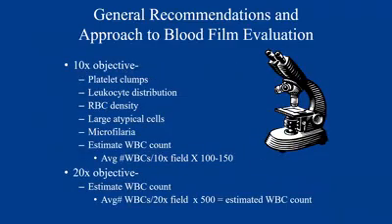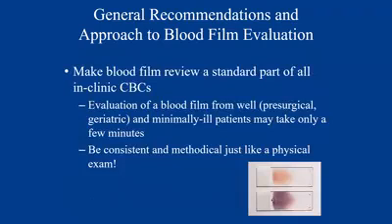I'm not going to go into exhaustive detail about what we do when we're actually approaching the blood film. Again, I'm assuming an introductory level of background that you already have. When you're doing blood film evaluation, you want to make sure you do your evaluation in the monolayer, which is generally about this area of the slide, where about 50% of the cells are about to touch but not overlapping.